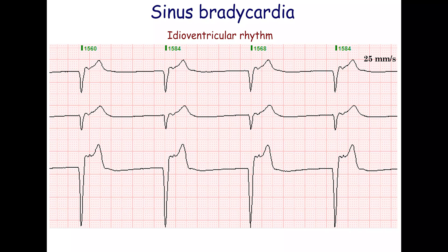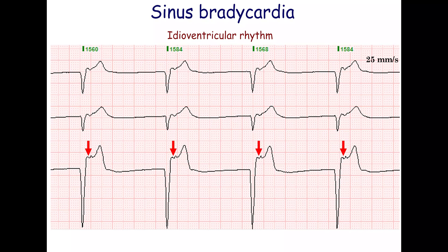The ventricular rate is between 20 and 40 beats per minute. A ventricular rhythm with a rate ranging from 40 to 100 beats per minute is called an accelerated ventricular rhythm. This ECG shows a ventricular escape rhythm at a rate of 38 beats per minute. The P-waves are indicated by arrows and are superimposed on the ST segments.